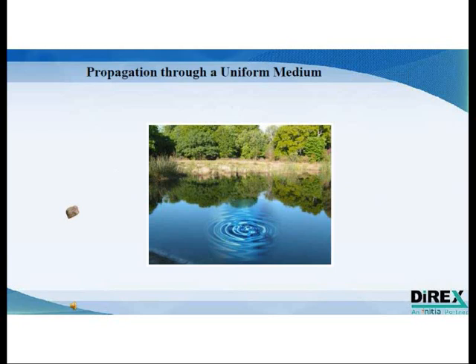As explained earlier, the shock wave is a pressure wave. You can imagine a stone falling into a pond and creating ripples. You have an initial impact, which then creates the transmission of energy through the water medium, which is seen in the form of waves.